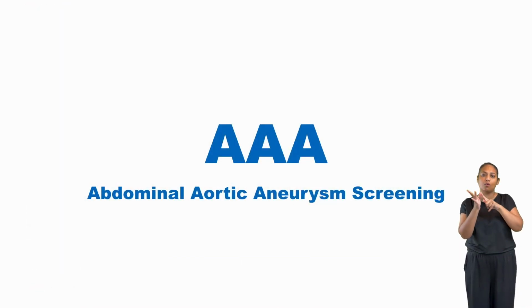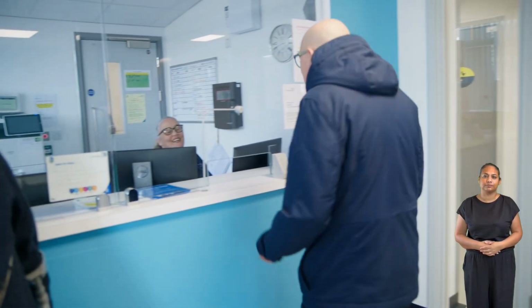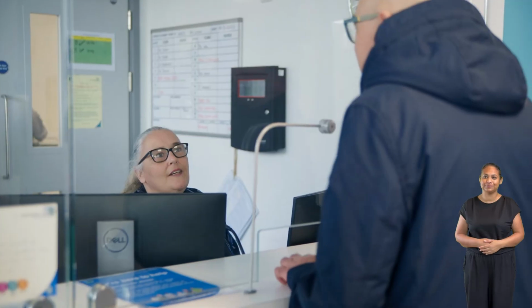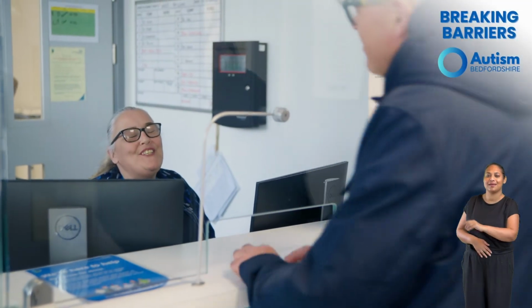In this video, we will show you what to expect from an abdominal aortic aneurysm screening. When you arrive for your screening appointment, you should check in at the main reception desk of the screening venue you are attending. The receptionist will confirm your name and then direct you to the correct waiting area.